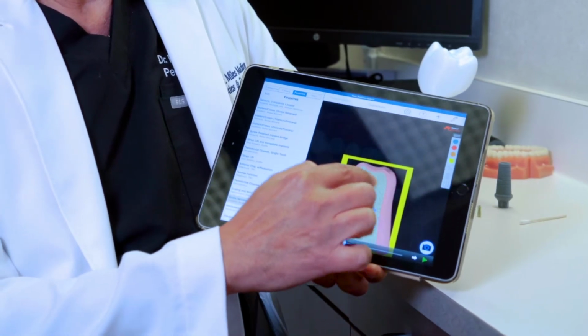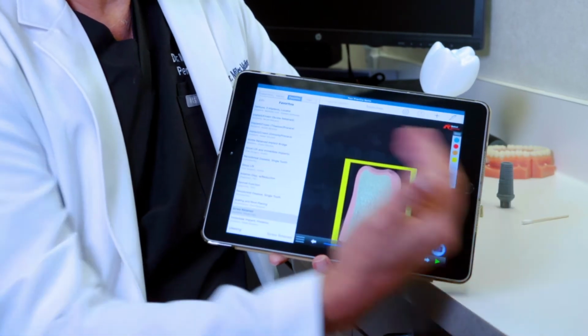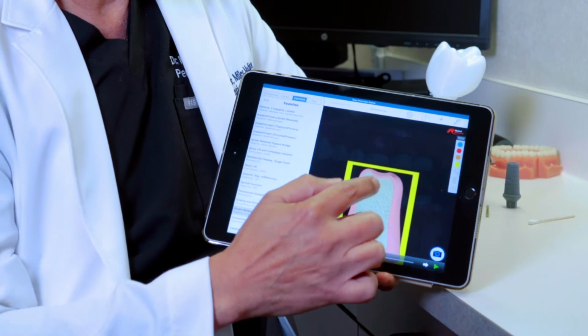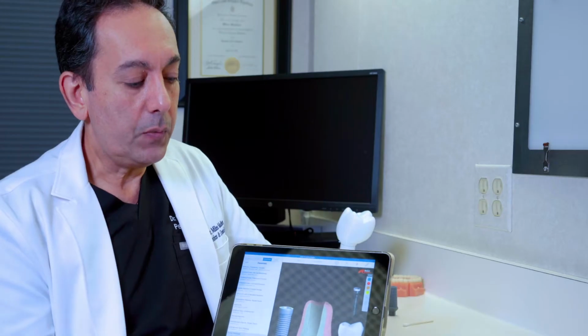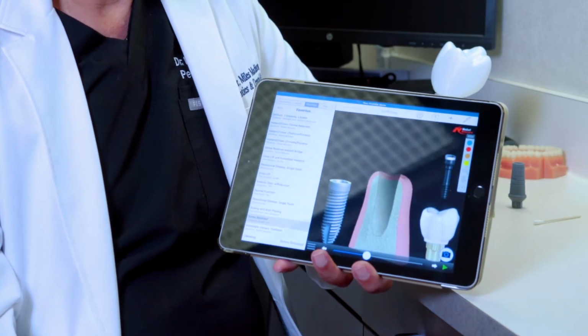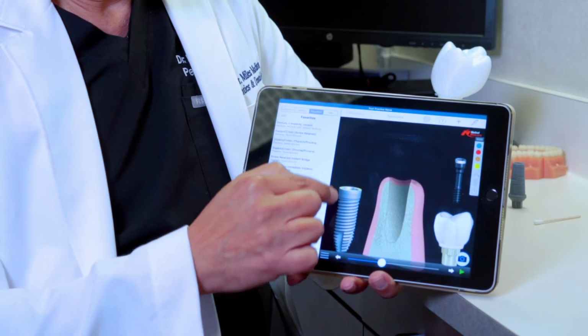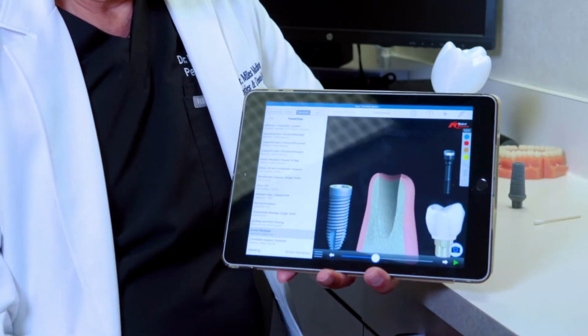So this is the jaw bone that we all have. So your cheek's basically sitting on this side and your tongue sitting on this side of this bone. So the first thing we do is we prepare a very small channel in the bone. And then what we do is we use a dental implant.